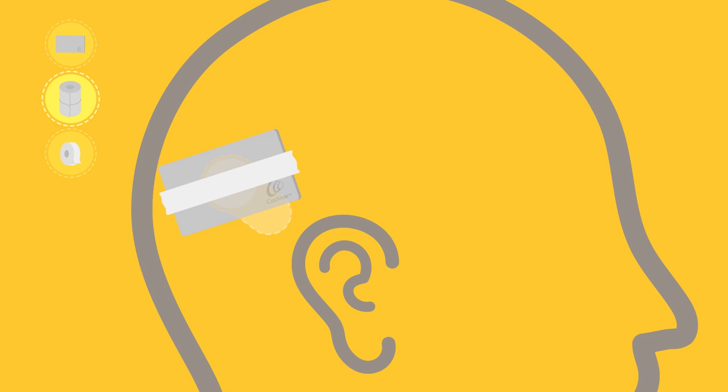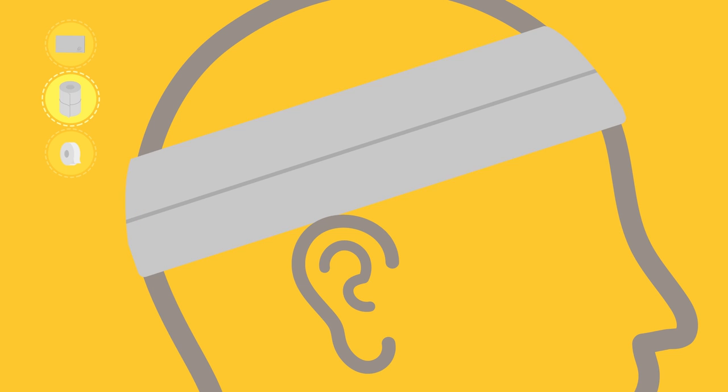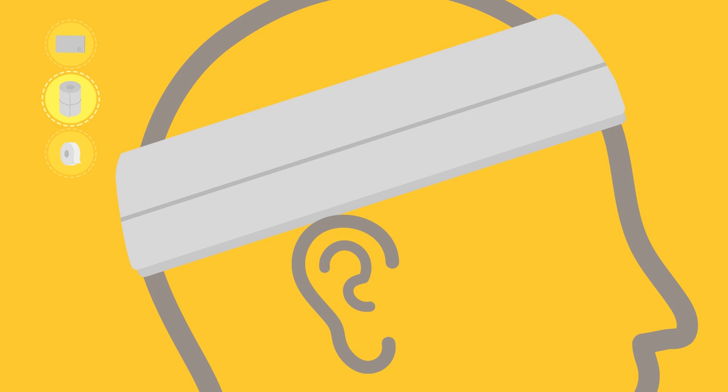Then, wrap the elasticised compression bandage around the head twice, ensuring the centre line of the bandage is fully over the implant magnet.